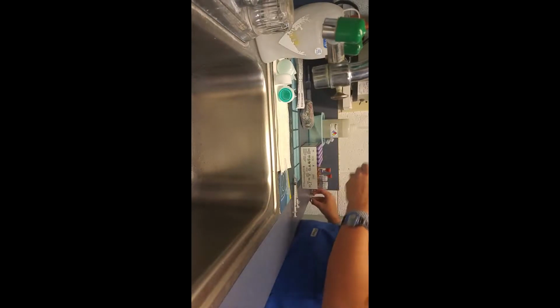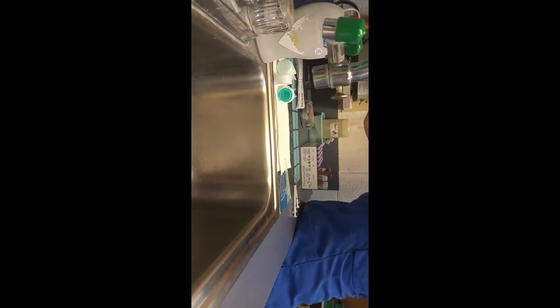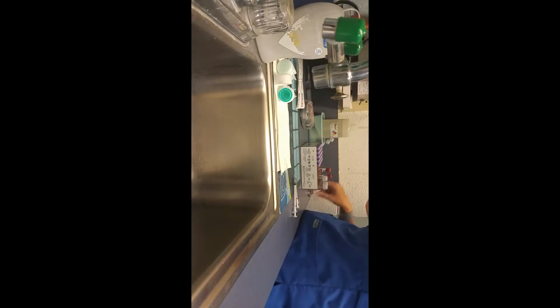Just some red blood cells sitting here. So we've got those there. Put them right there, and then I'm going to use this new tube. Pull out my other sample, which is the donor. I'm going to do the same thing.